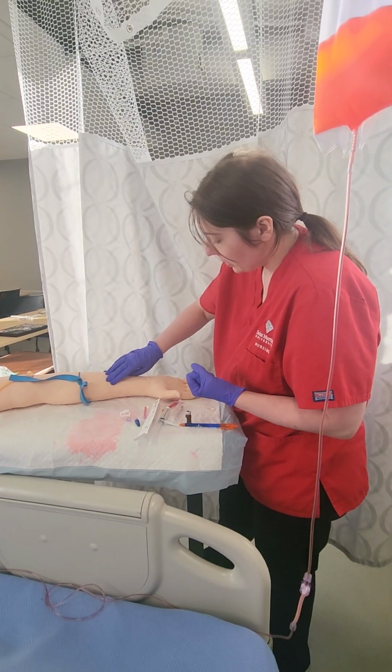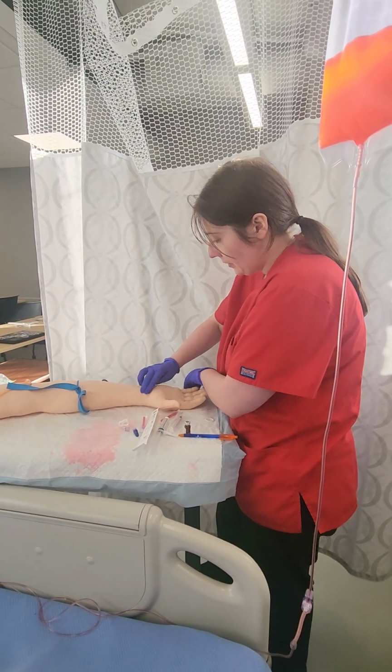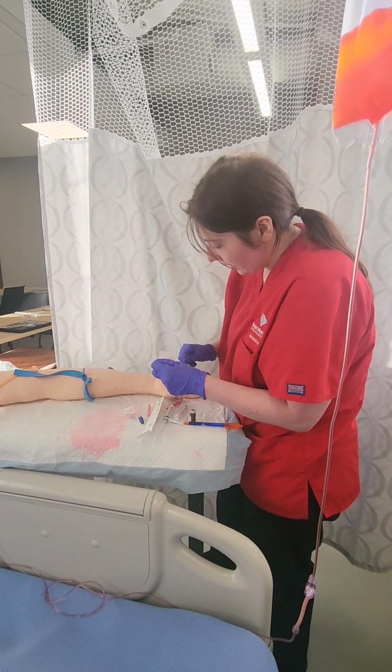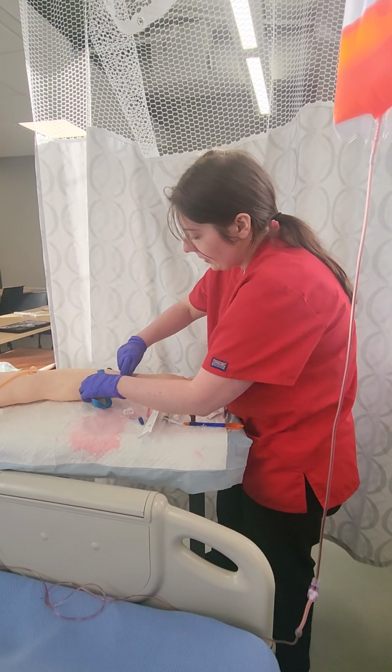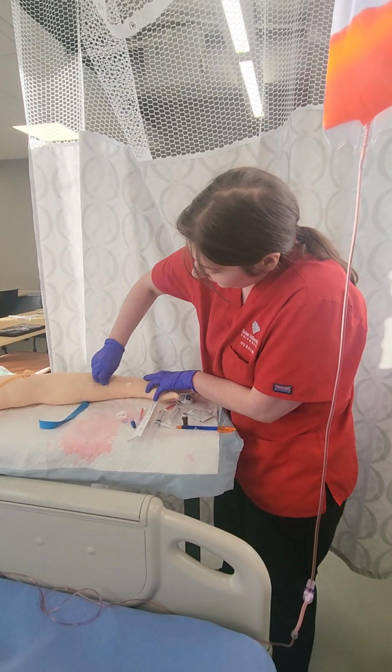Can you open your hand up and down, up close? Yeah. Okay, good. I still feel your pulse. Okay, that's a good spot. Okay, gonna let that go there. And I'm going to scrub real hard there.